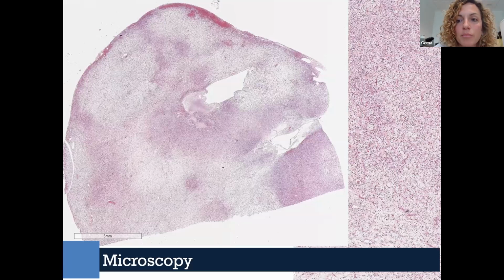If we see the morphology, all the tumors look the same. We didn't have this abrupt transition between adipose tissue or recognized tissue and another sarcoma. So at first, we didn't think of dedifferentiated liposarcoma. The tumors include heterogeneous areas, very edematous, not myxoid in the background. The Alcian blue was negative, and there were also cystic spaces in between. There was a kind of zonation. We're going to see it in detail.